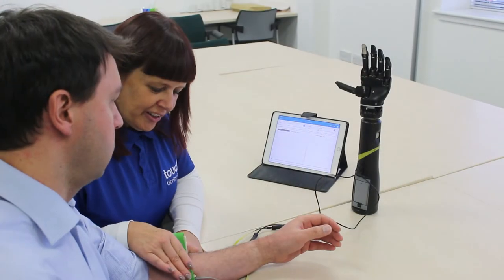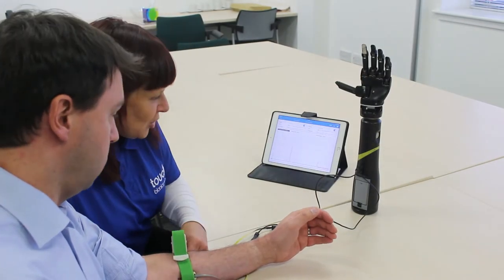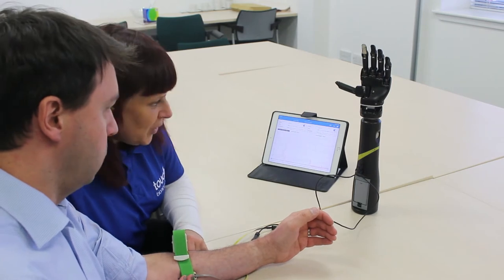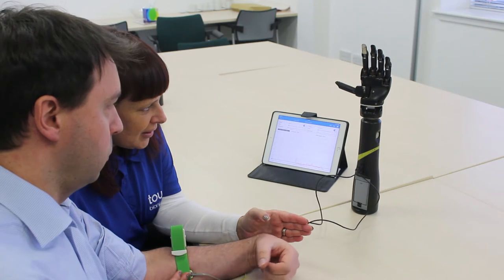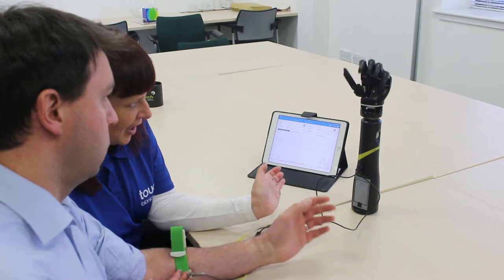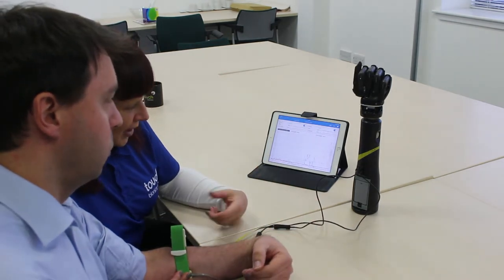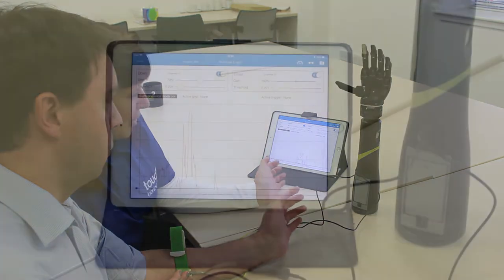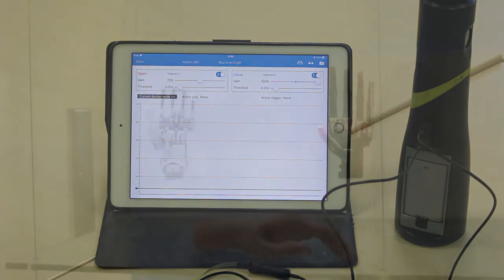What we're doing here is finding the muscles in the arm to activate the hand. We can get the patient to close the hand, and then to open it again. We're using an app on our iPad and we can see the muscle activity that the patient is using to activate the hand.